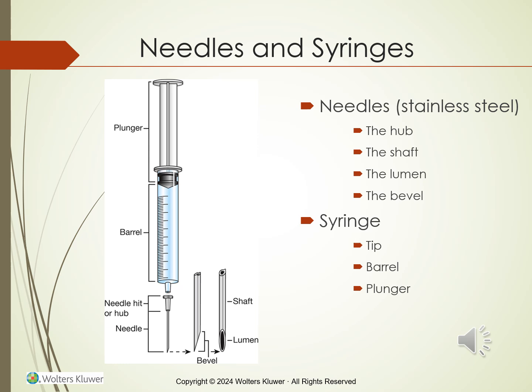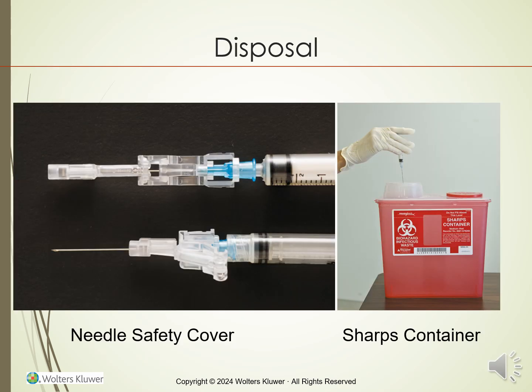All syringes are measured in milliliters and range anywhere from a small size of 1 ml all the way up to 50 ml. All needles, as well as syringes, need to be disposed of properly for safety. Needles can be disposed of into sharps containers that are usually the color red and easily identifiable within the department.